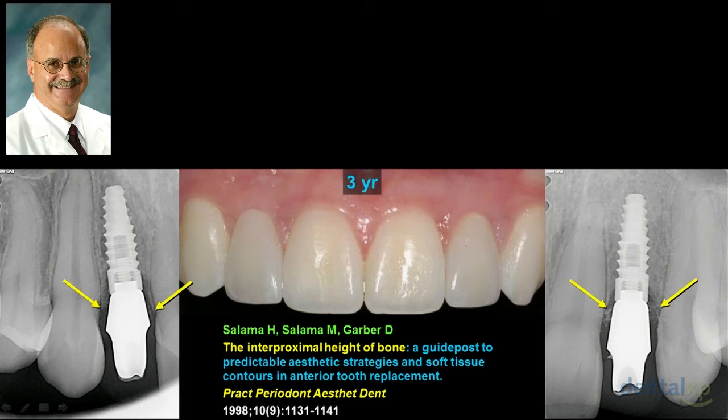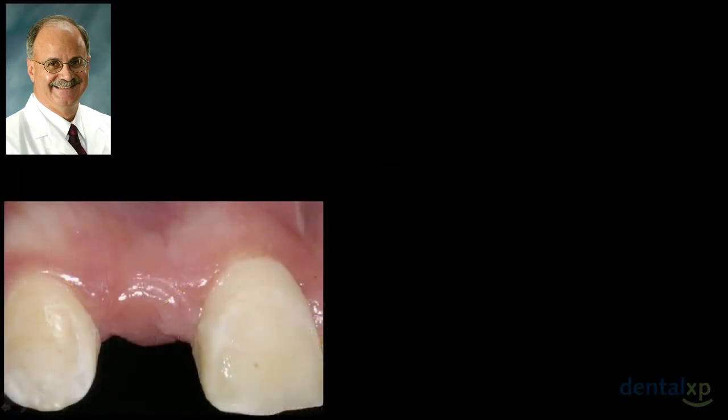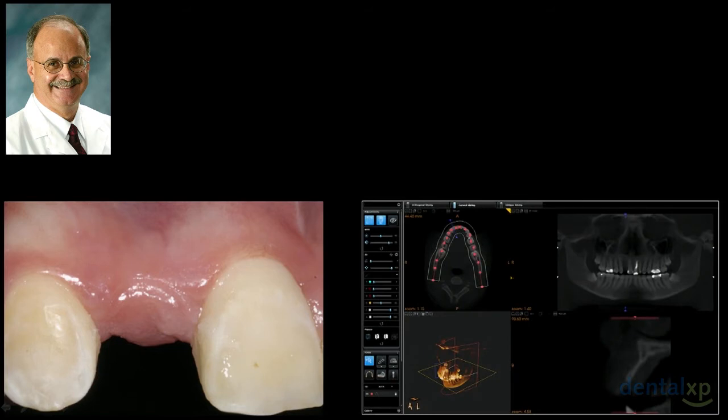So we took this patient and used an autogenous bone and got a not-so-bad result. I think you'll agree. She's 3.5 years, well, 3+ years out now. She's really 4+ total. This is Victoria. Now, Victoria was 17 at the time, and she comes to us also with a congenitally missing lateral incisor, 1 tooth only, just the maxillary right side, as you see here. And if we looked at her clinically, we would maybe start to assume that, you've seen one, maybe you've seen them all. A lot of these folks are horizontally deficient, sure.